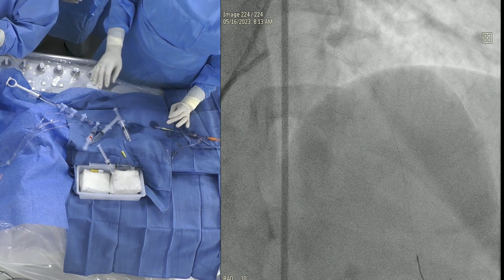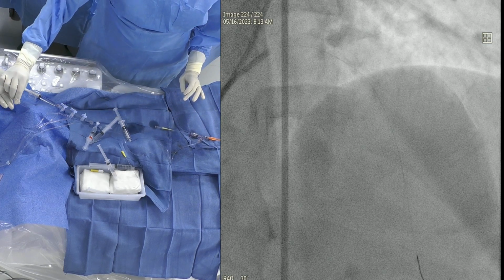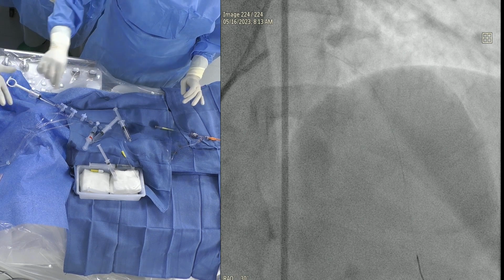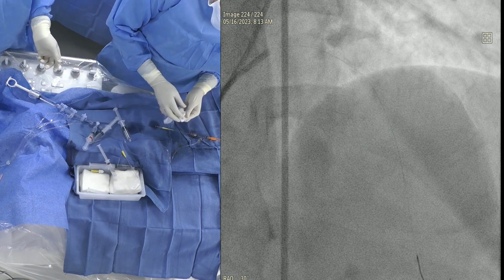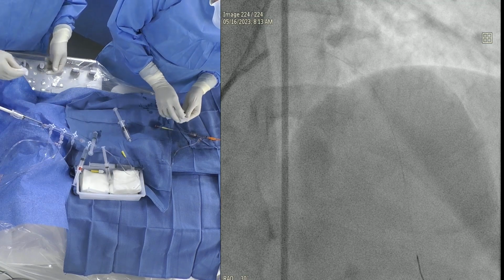Anu, great job with the wire. In the meantime, Dr. Savan Jalnapurka is asking, what is your wire strategy? Why the Fielder? The answer must have become already obvious.